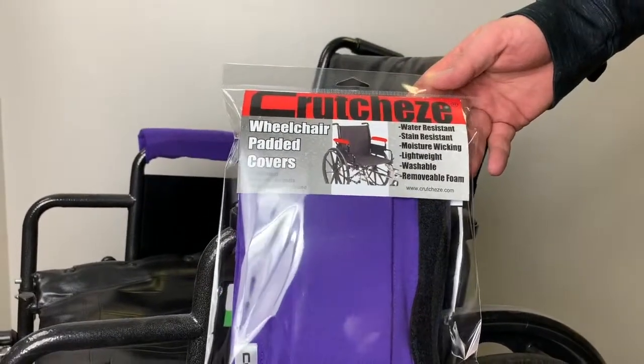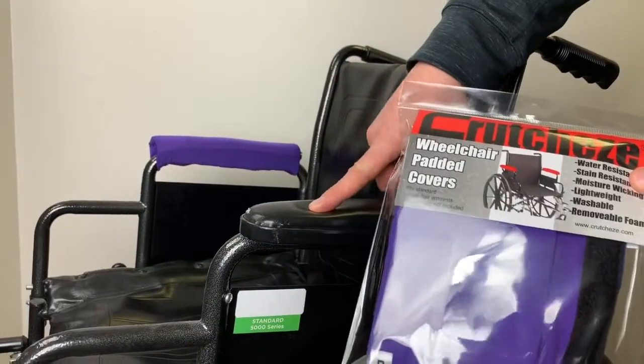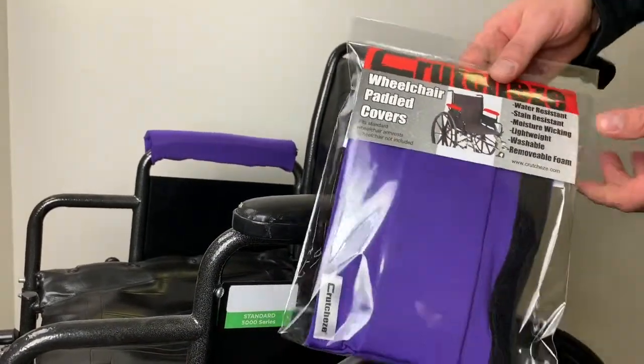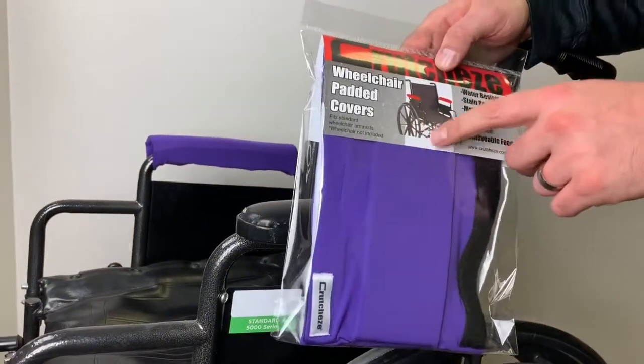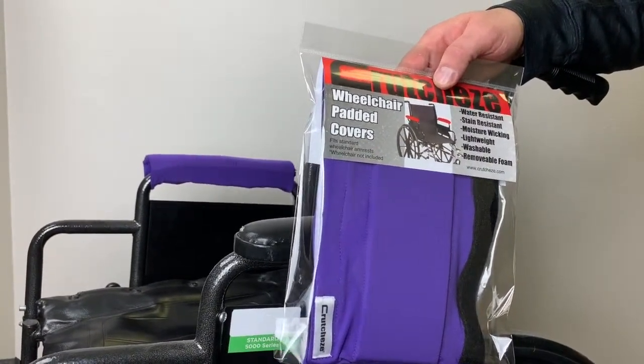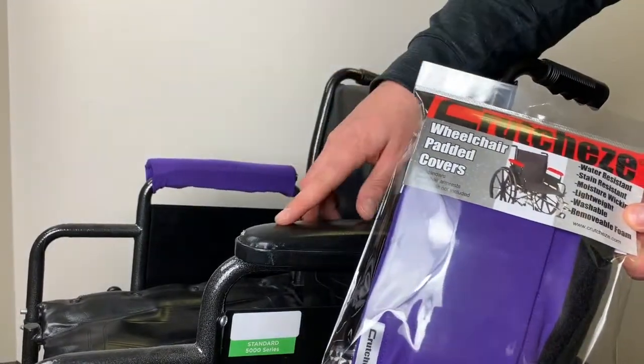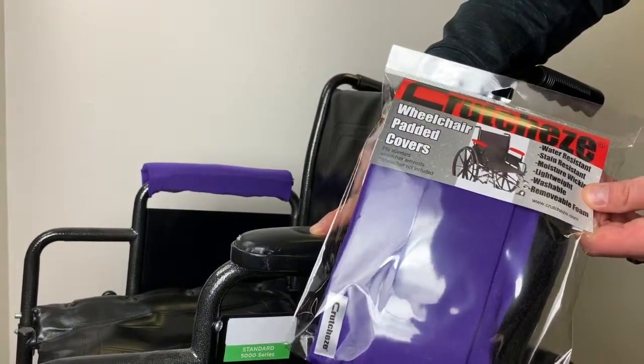Thank you for buying Crutchy's wheelchair padded covers. It's meant to go over your existing armrest on your wheelchair. It helps — it adds support and comfort with the padding on the inside, abrasion resistance, and it could prevent your armrest from getting too hot.